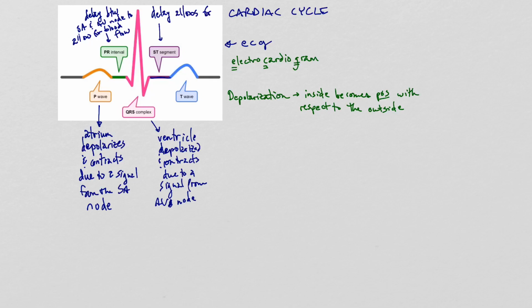So this delay allows for blood flow. And then we get our T wave. This is the repolarization of the ventricles.